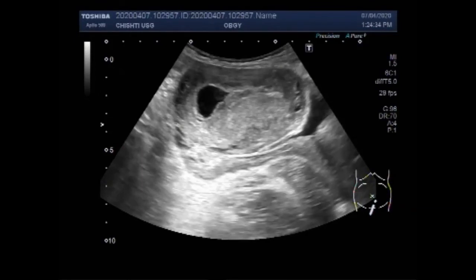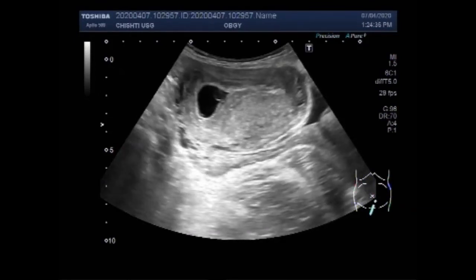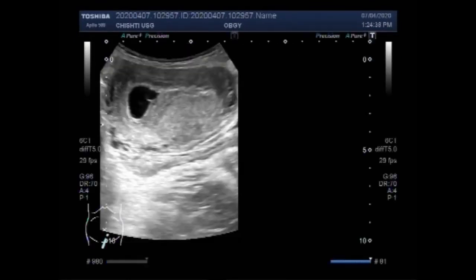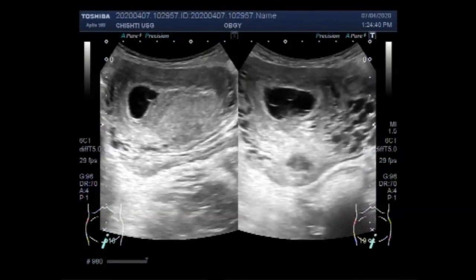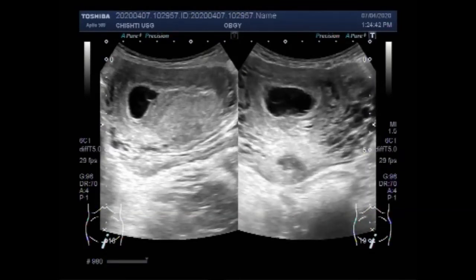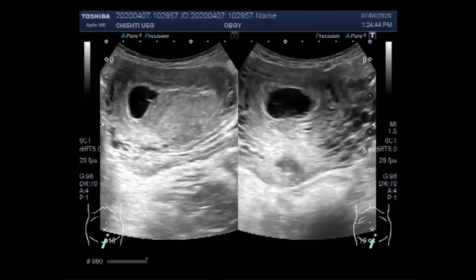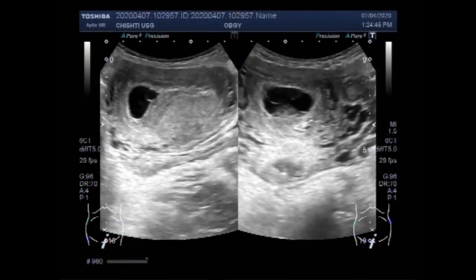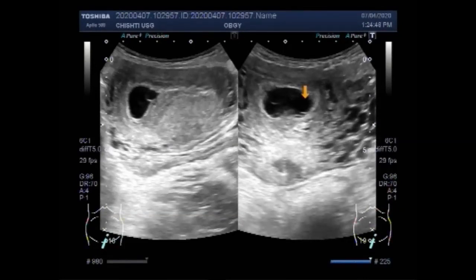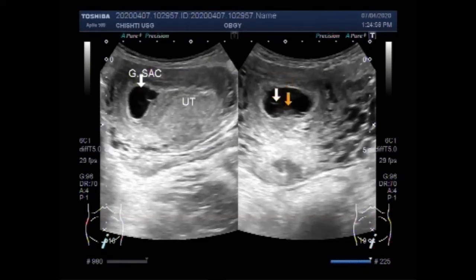The yolk sac is a membrane sac attached to the embryo, formed by cells of the hypoblast adjacent to the embryonic disc. This is alternatively called the umbilical vesicle, but yolk sac is far more widely used. In humans, the yolk sac is important in early embryonic blood supply.